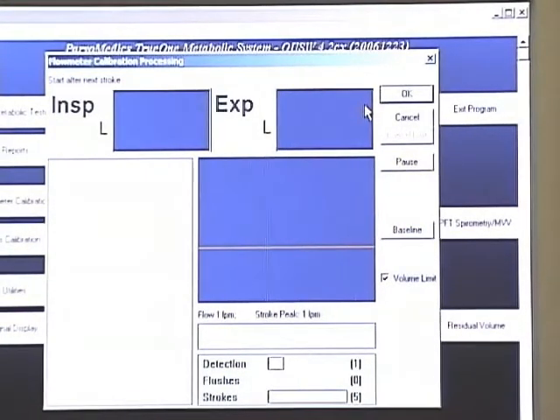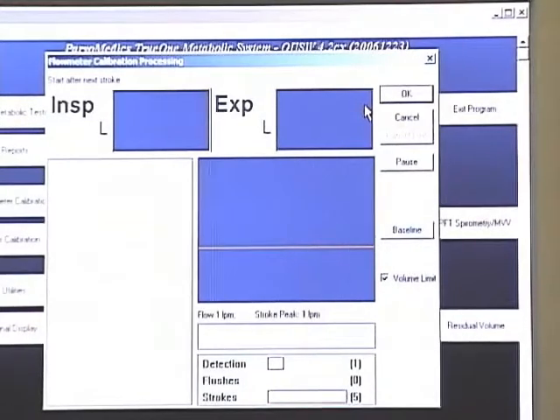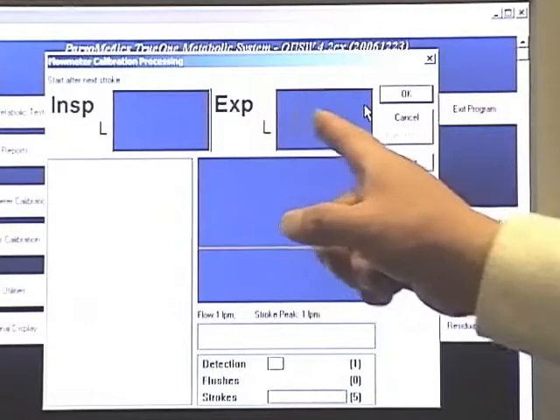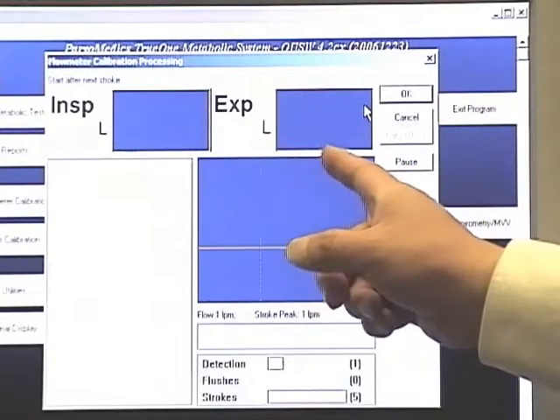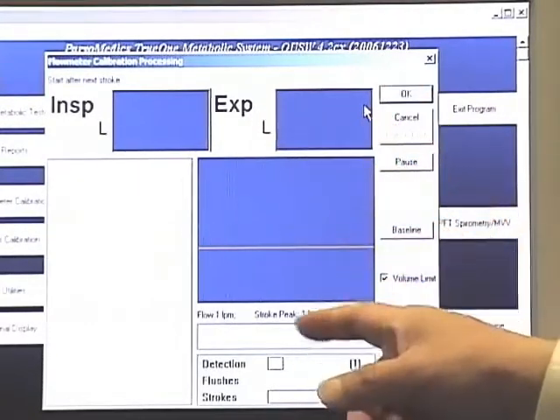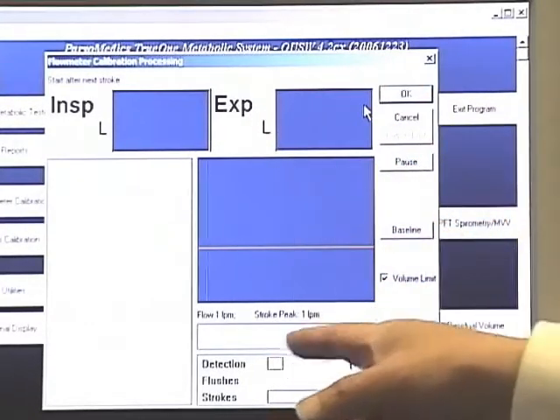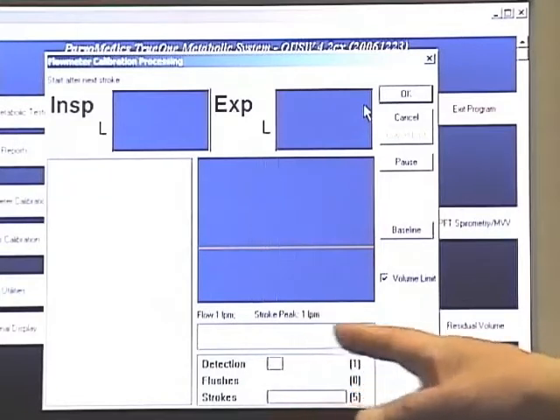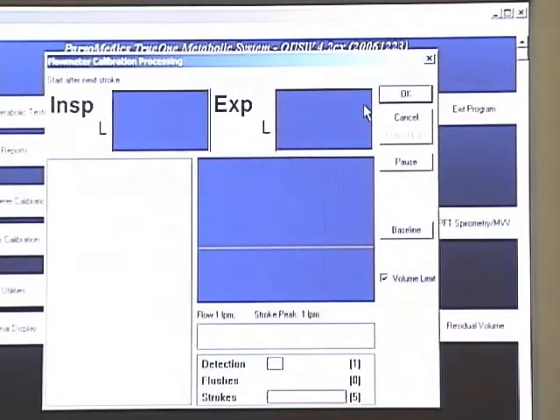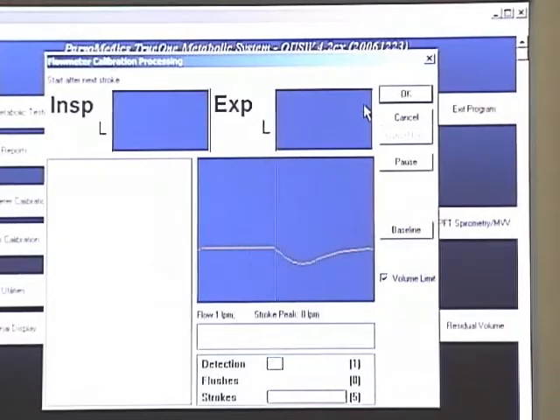It has both an inspiratory and expiratory instead of expiratory only, and also it doesn't have flushes. The first one will be a detection and you will see the waveform go negative and then go positive.